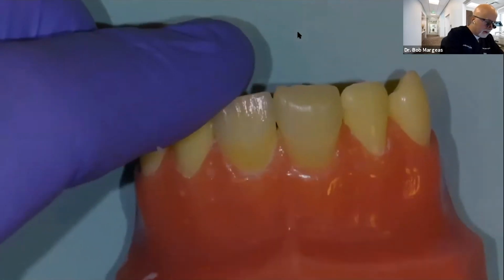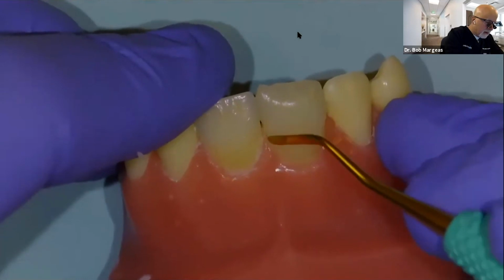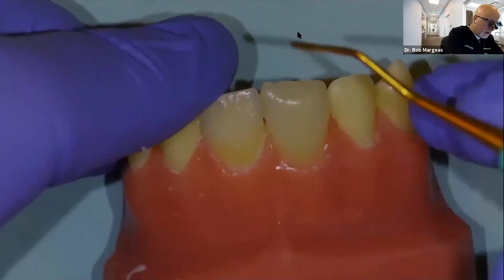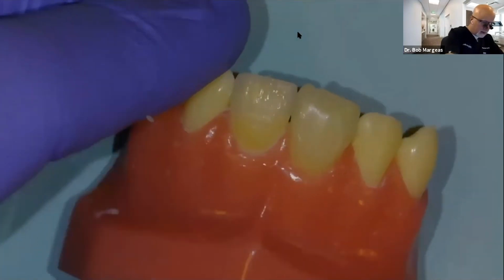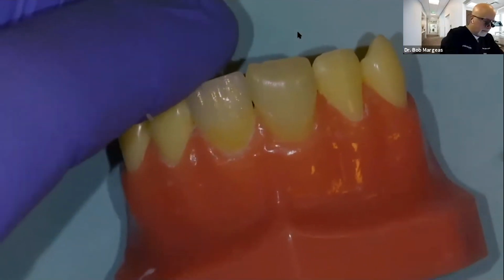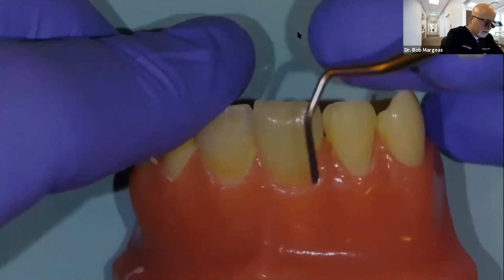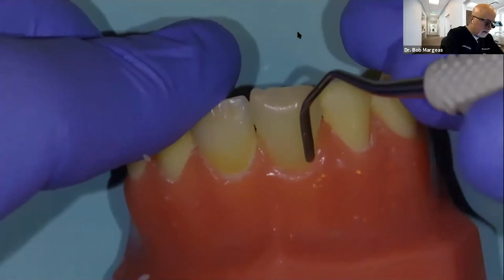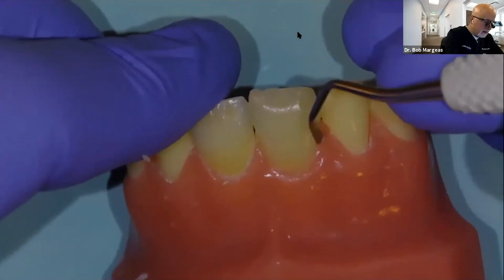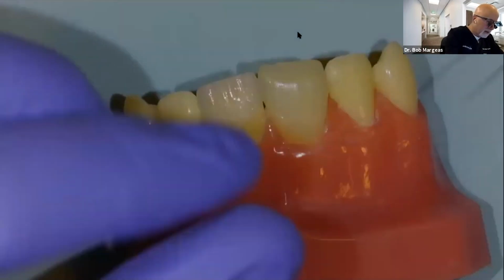The beauty of the REJ is it's so thin. This and the composite instruments, very, very nice instruments. This is the Ninja. The beauty of the Ninja is look how thin this is, and it's sharp. I can cut the material because I don't want to see where there's a margin.